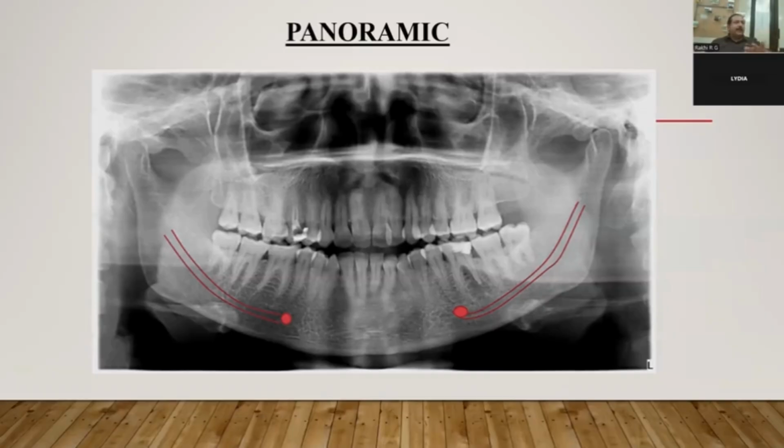So we need to take care of completely covering it, which will be an additional burden for you. If you have a natural barrier membrane, that is your APRF gel-based barrier membrane, you can have a little bit of exposure of it as well. It stays there for a week, and it takes up to a month for complete resorption. So that is also a favorable side of a natural barrier membrane like PRF. So that can be tried here, or rather you should be trying that as well.